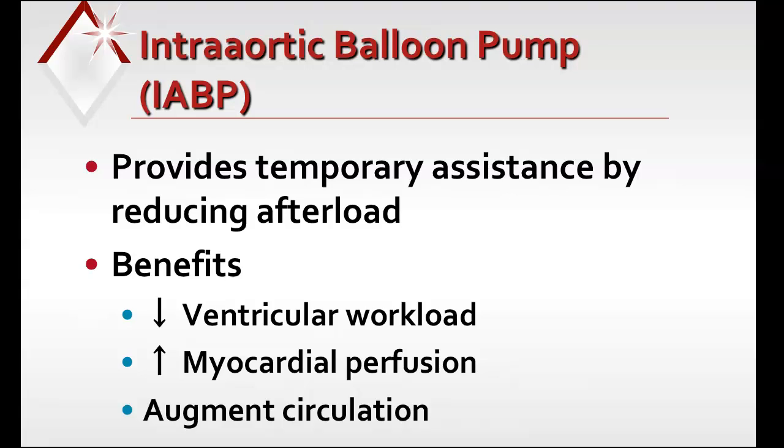So there are a lot of benefits to this. There are some contraindications as well. You can't use it on anybody with irreversible brain damage. You can't do this with anybody with major coagulopathy issues, like DIC, for example. You can't use this on anybody with terminal or untreated diseases. Absolutely can't do it for abdominal aortic aneurysms or thoracic aneurysms. You also cannot do this for people with generalized peripheral vascular disease. The other thing that's important to note is that this is temporary use only. Again, it's a bridge to something bigger.